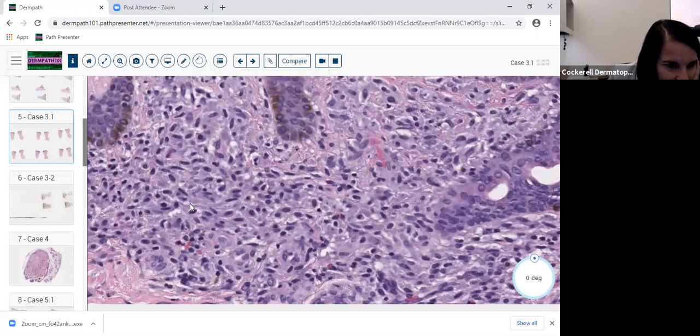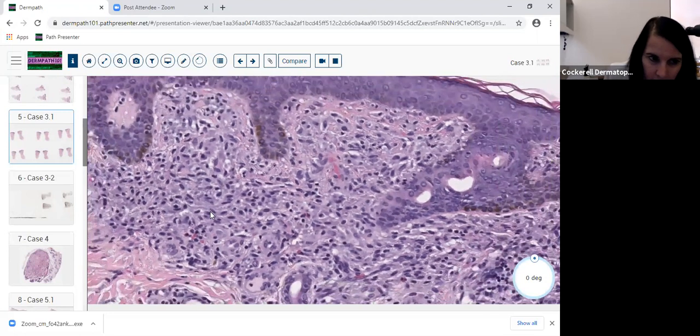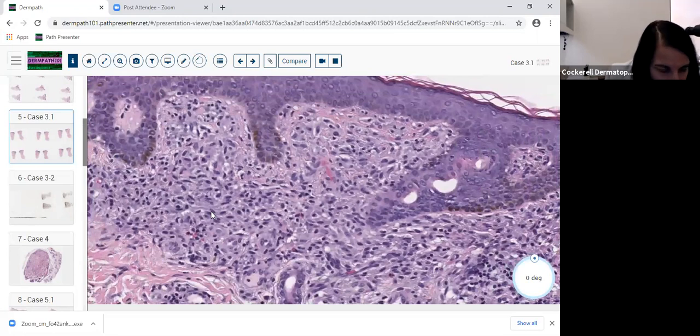Now, a mast cell isn't a basophil. A basophil has two lobes, and it's typically in the peripheral blood, not in the tissue. So these mast cells are sort of related to a basophil. So these are mast cells. Some people can look at these and see that they're slightly spindled, see the amphophilic cytoplasm, boom, mast cells.